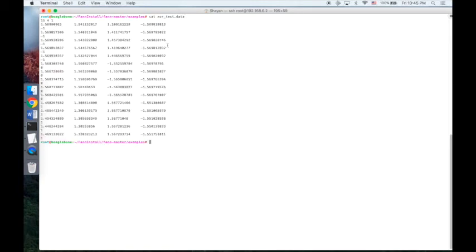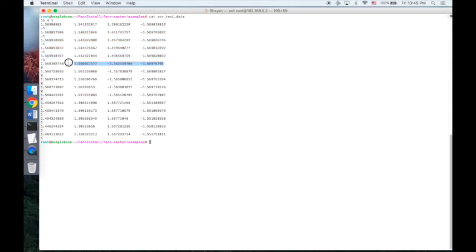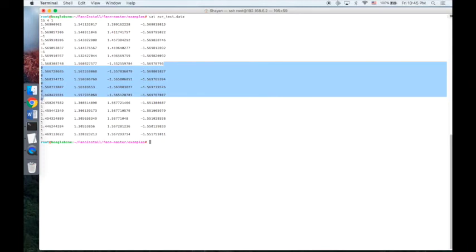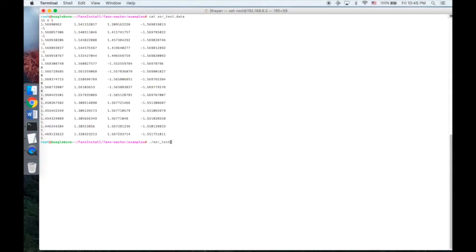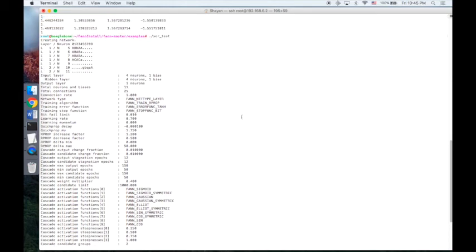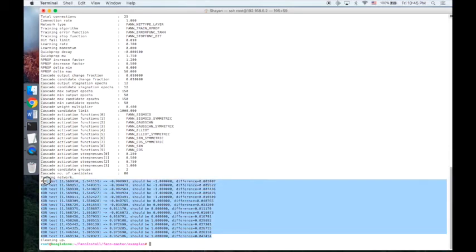Now this is the test data file. For testing, we used 5 trials for each of the motion types, which are different from the training trials. Now we have 5 trials to test for the -1, which was the short stride motion, and 5 trials of data to test for type 0, which is long stride motion, and 5 trials of data to test for sitting motion. Now the system has performed the testing, and the testing is very successful. As you can see here, all of the errors are below 0.1.